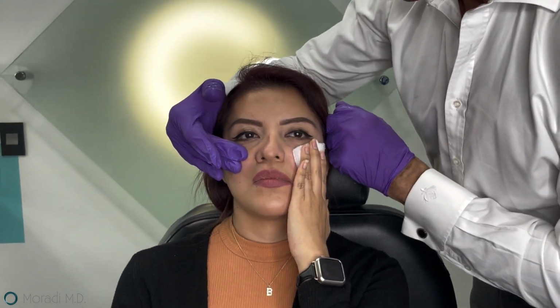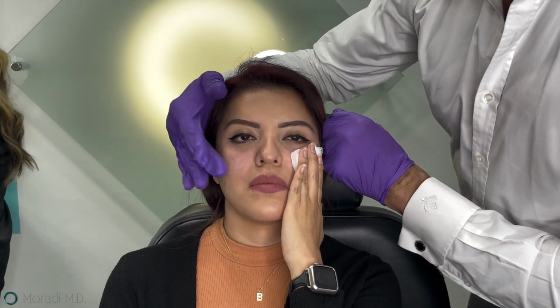Another session in the future, we will work on the infraorbital hollow using a little bit of chlorhexidine just to clean the area. And then we're going to keep a little pressure to decrease the chance of bruising in this area. And then at the end, I like to go ahead and make sure it's massaged smoothly, and we use some arnica gel for that.